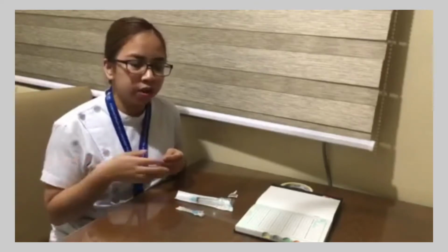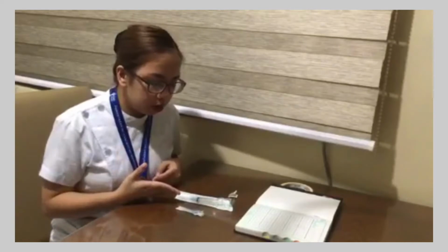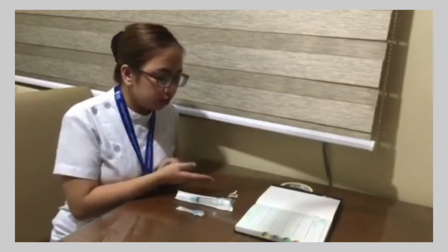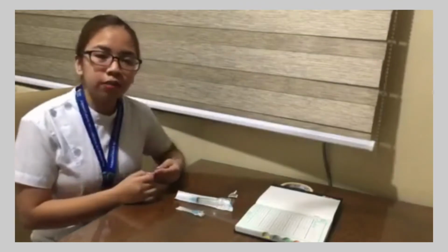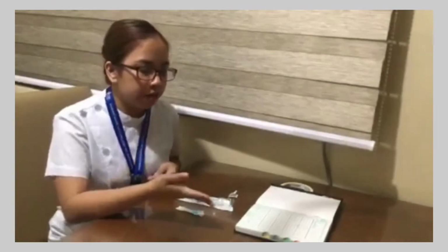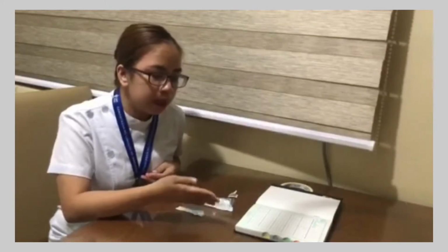Moving on with our materials, we have the MAR, a syringe with needle, a filter needle, aseptic wipes, and the vial. I've already performed my hand hygiene. Next, I'm going to check my MAR and look for the medication that I'm going to need: the name, the drug dose, the route, and the time.